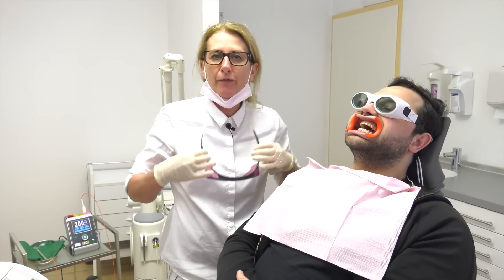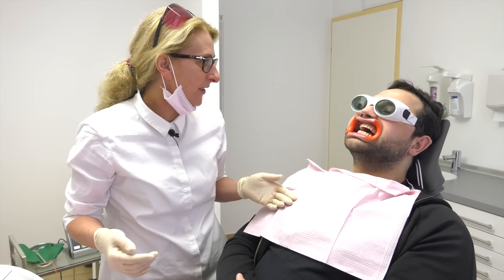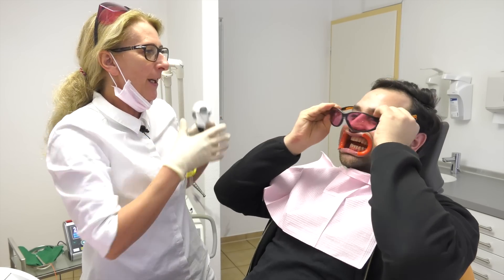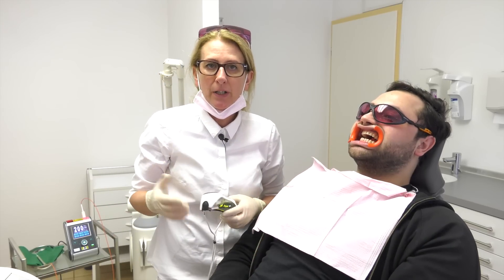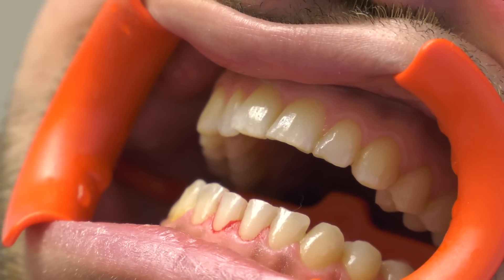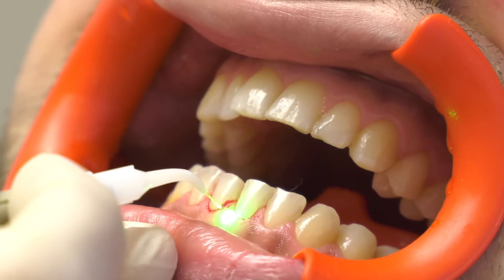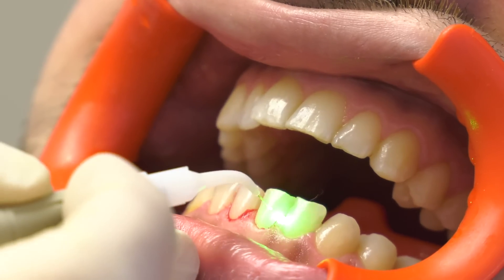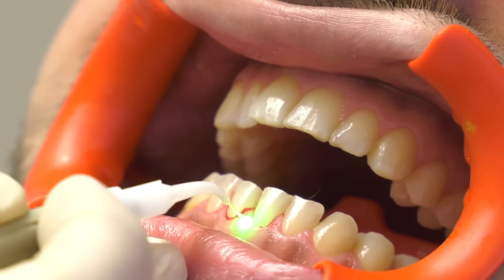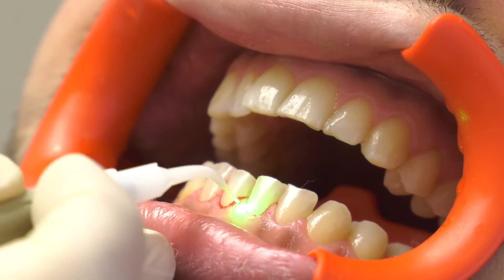The tooth surface is clean and polished. To move to the third step, we have to change our laser safety glasses. The third and last step is to get rid of the hypersensitivity at the tooth neck. I told you we have three possibilities: you can use the Erbium YAG, the Neodymium YAG, or the diode laser. In this case, I prefer the diode laser because it has a very deep penetration depth, and so we are able to take off the sensitivity.